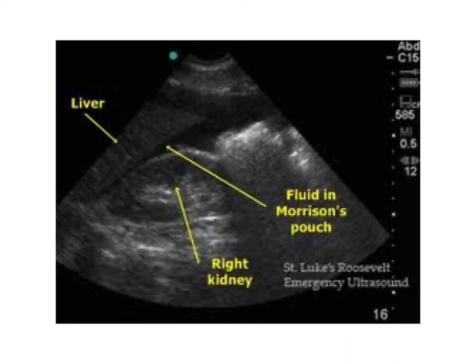It is up to you to decide further, depending on where you are working, your team and the hospital availability, whether you can request a CT scan. But the first thing is X-rays and ultrasound. That's very important to know.